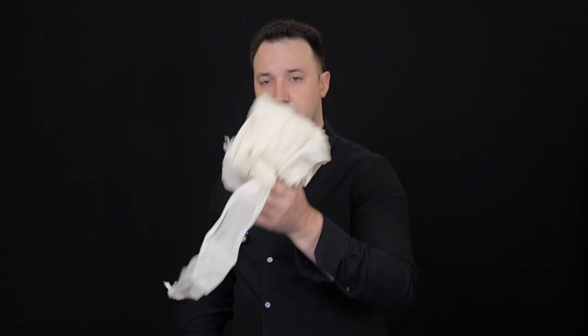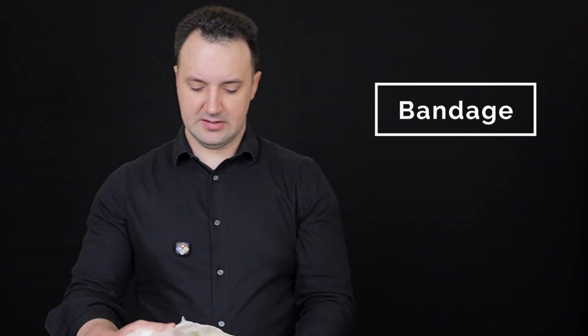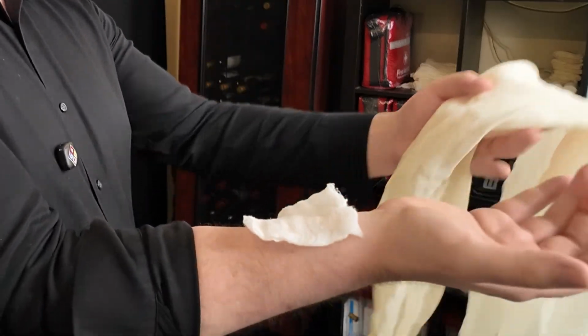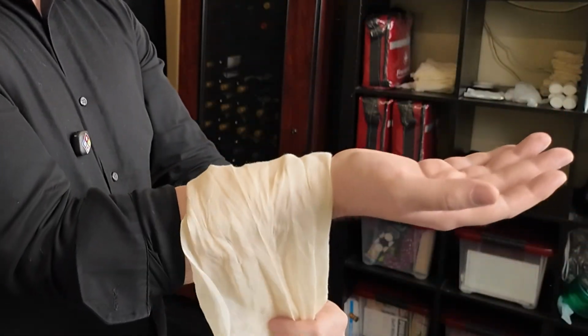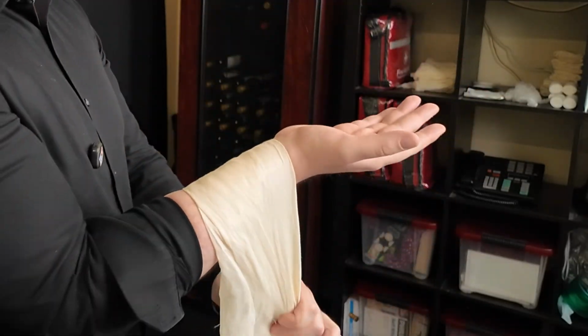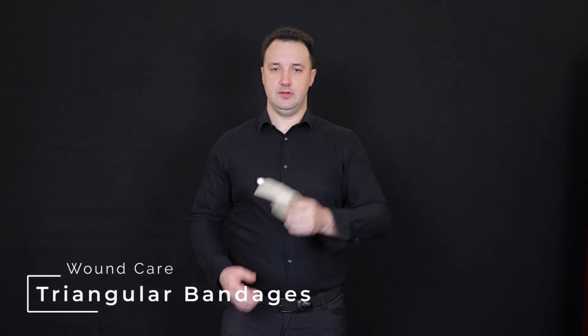Bandage, and I have some sort of bandage here. A bandage is anything that you use, pretty much, that secures this dressing to the wound. So if I have dressing and I have bandage, I can secure this. Tie it, use tape, whatever. That's the basic idea. Using a triangular bandage.